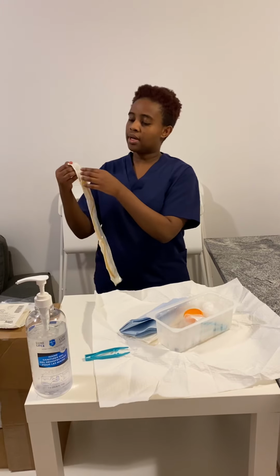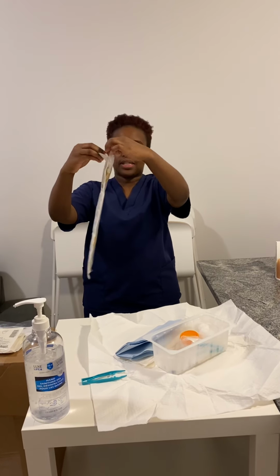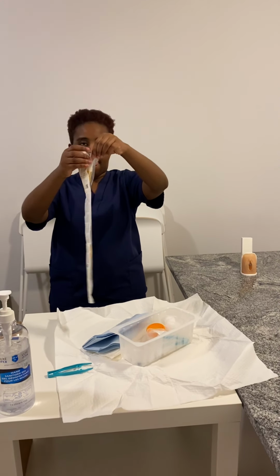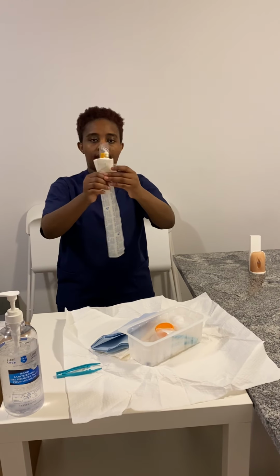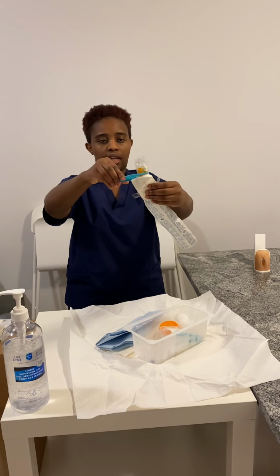To avoid any contamination, I'm going to open my catheter. I have to make sure that it's above my waist, not below my waist. And now I can use my forceps and pull it gently and away from me to avoid any contamination.